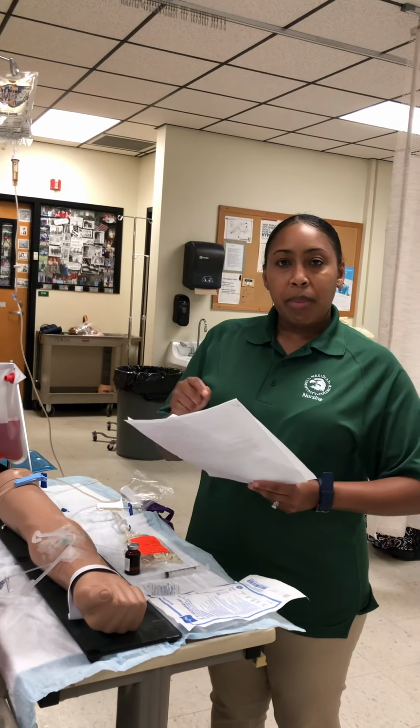I'm going to talk about both of them at the same time. And this is our gentamicin. We have a 100 milliliter bag, and we already have the label on it, so we have the right medication. We're going to make sure we're giving the right dose. We know that we are giving the right dose because we already did our calculation prior. We're going to make sure that we give them by the right route. Our furosemide is going to be IV push. Our gentamicin is going to be IV piggyback, and we're going to give it at the right time.